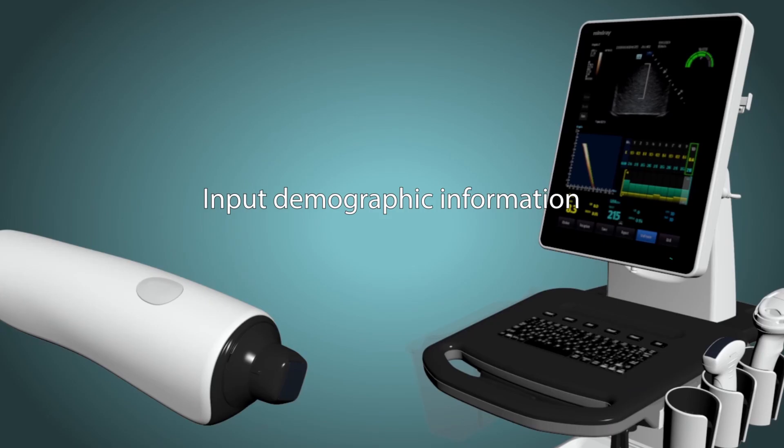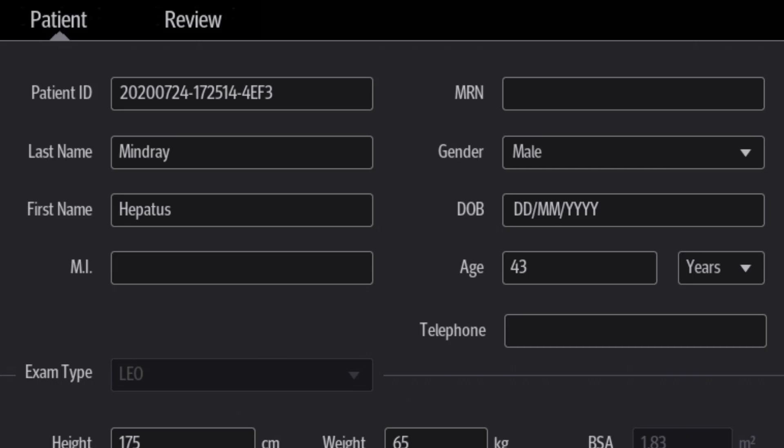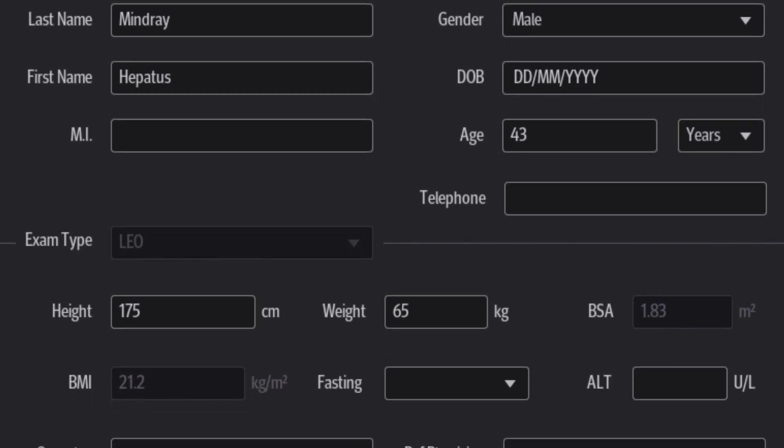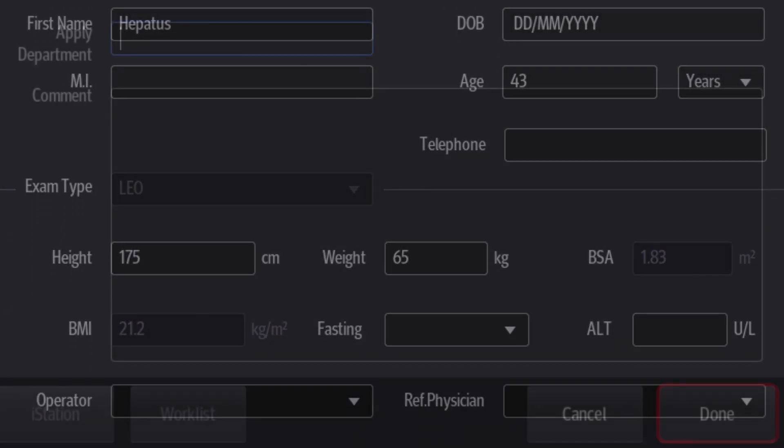While the patient is relaxing, you can input the patient demographic information: name, sex, age, height and weight, and so on. Then just click done when you're finished.